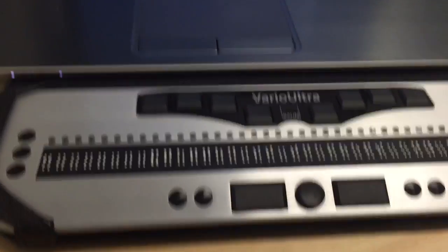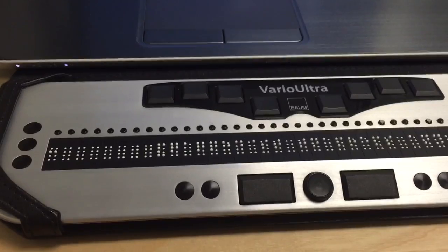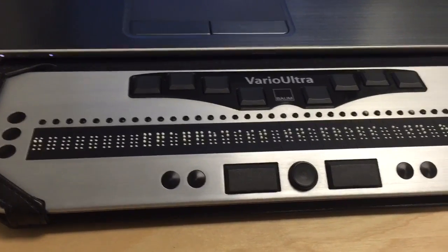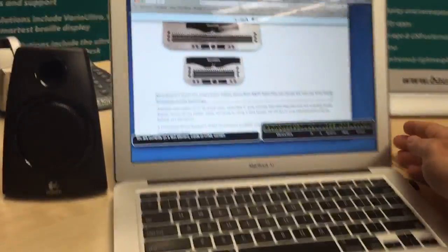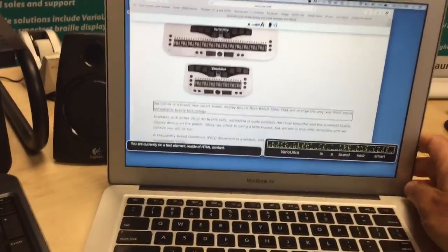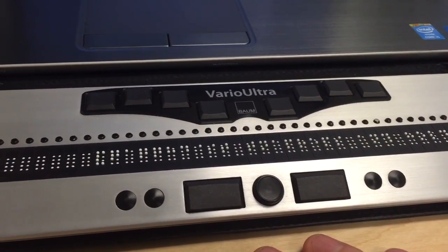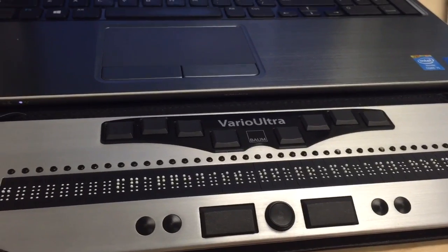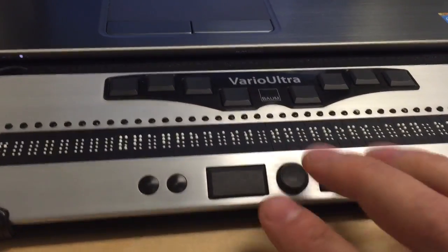One of the beauties of Vario Ultra — again, we do call it the smart braille display — is that you can connect with up to five devices simultaneously. I have a MacBook Air on the table as well. It is connected via Bluetooth, already paired and connected to this Vario Ultra, simultaneously. The Windows computer does not know that we are also connected to the MacBook at the same time.